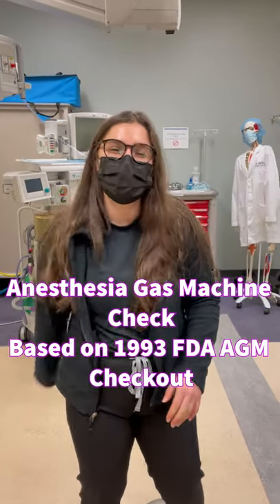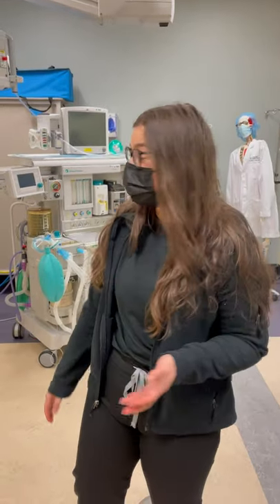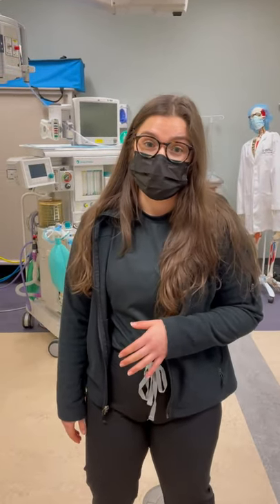Hey guys, my name is Sydney. I'm an SRNA. I'm going to show you a gas machine check. You're going to have some checkoffs that you need to do, so I'm going to do that for you today.